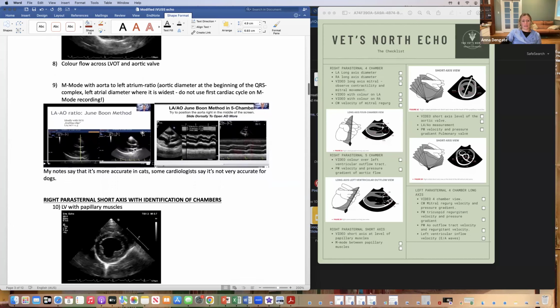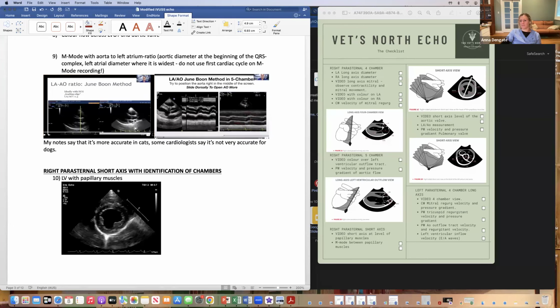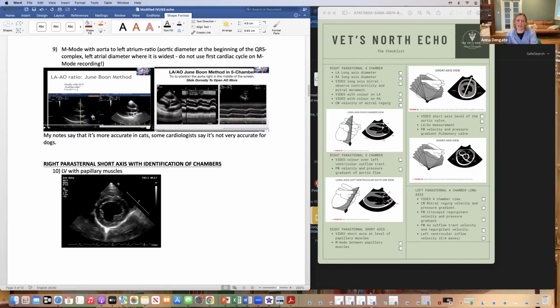Now this is one that I'm consistently not doing. The M mode LAAO. I've tried a few times, and she's just so grossly underestimating the left atrial width in an M mode. So we're in our 5-chamber view. We've got our line directly across the aortic valve, and sitting right underneath that is the left atrium. Is anybody having better luck than me with this view? I've been practicing doing it, but I haven't actually been taking the measurements because I haven't put the ECG on.